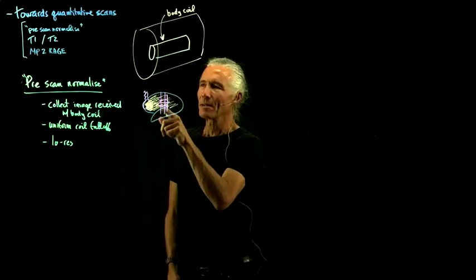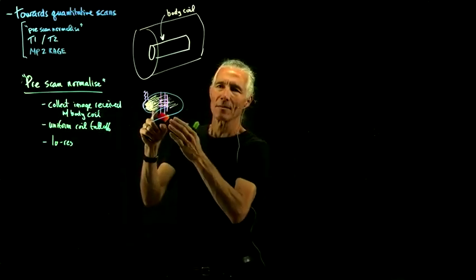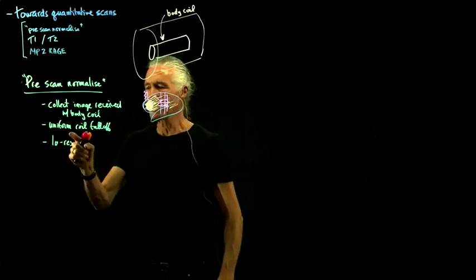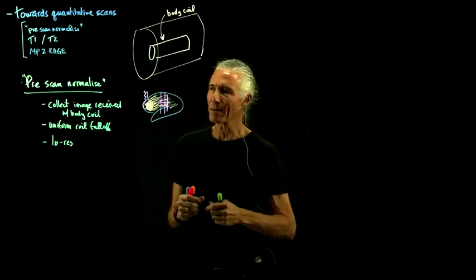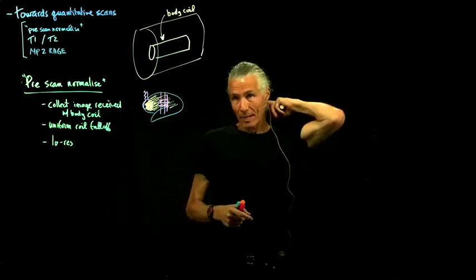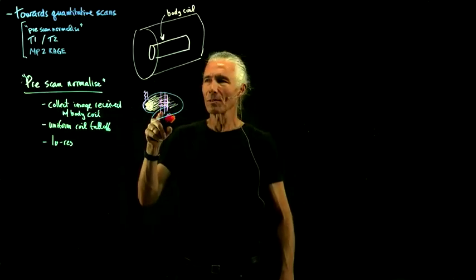So say you take an image that doesn't have very much gray-white contrast, and you've got gray and white contrast in the high-resolution image. If you divide by this one, it will essentially remove that brightness signal. And there's little more complicated things you could do to make it work pretty well. But that's a big help, because that will sort of flatten out your image. It's not really quantitative, but it will at least make another measurement that you can use to correct your measurement. Now, you could obviously just use a computer program to try to flatten out the image afterwards.